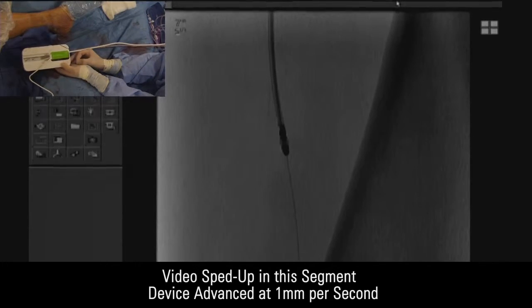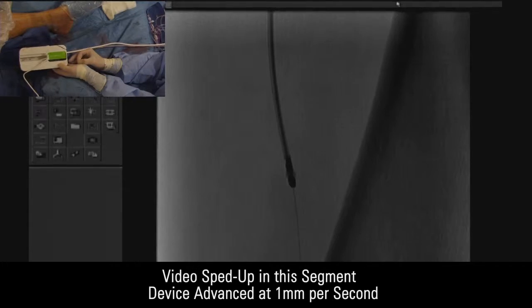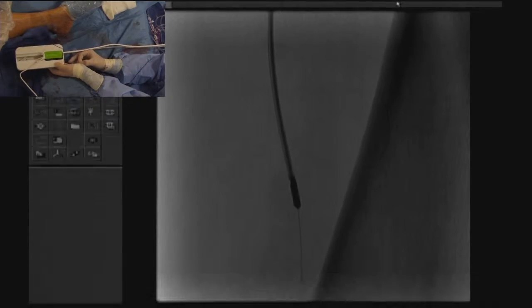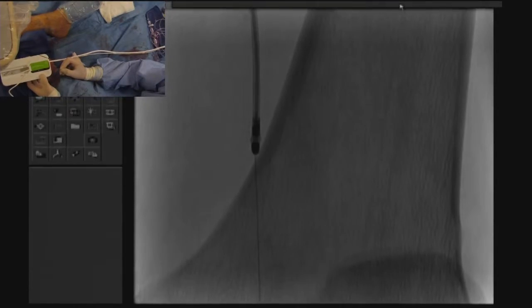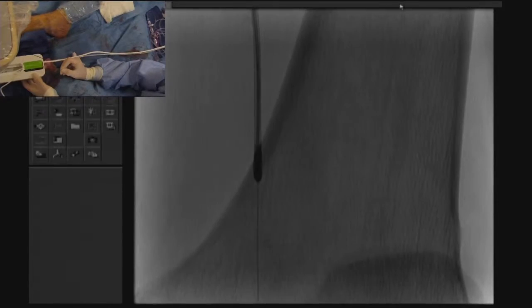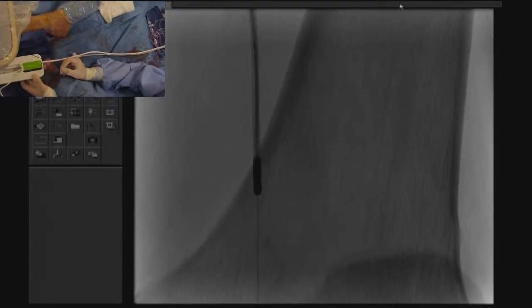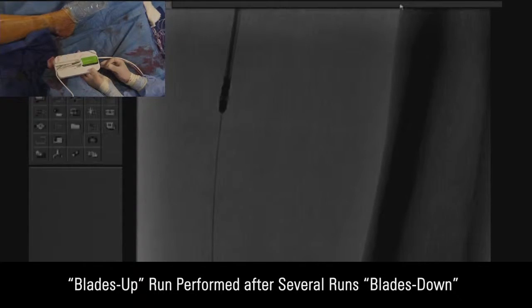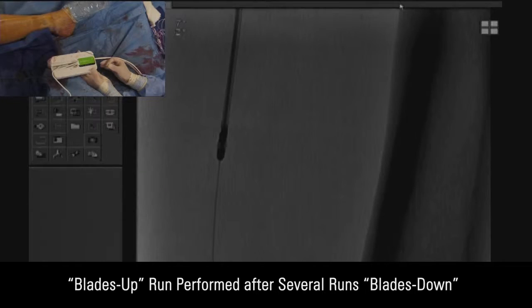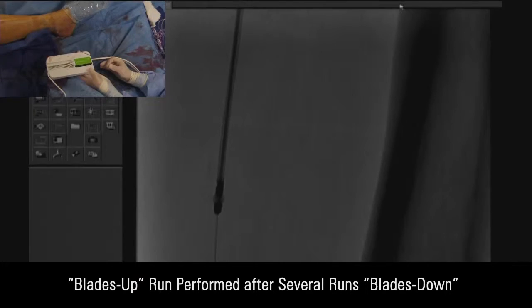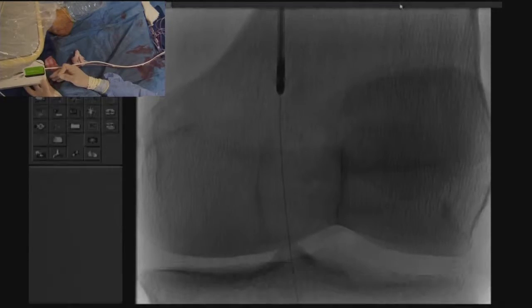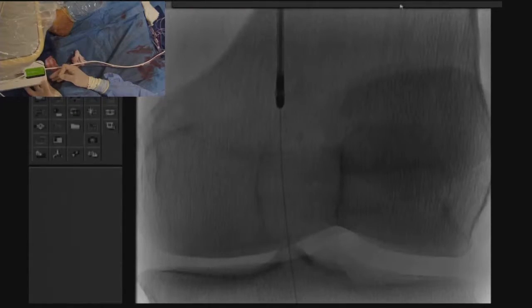In this clip, we're speeding up the JetStream a little bit. Essentially it's a device you can watch under fluoroscopy, listen to the pitch change, and watch how it performs even under ultrasound guidance. Some people describe the wobbling effect of the JetStream — after it traverses a CTO segment, it starts to move around, signifying that you are in free space within the vessel. That's usually a good sign. Always moving slow in a thoughtful and precise manner is very helpful, especially with the JetStream device, and it will pay off eventually.